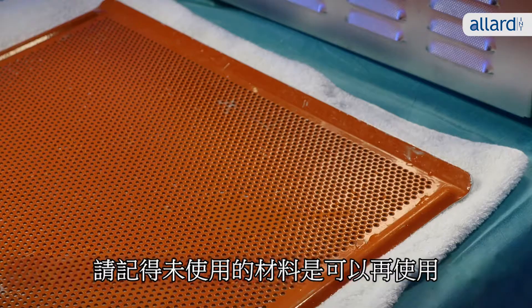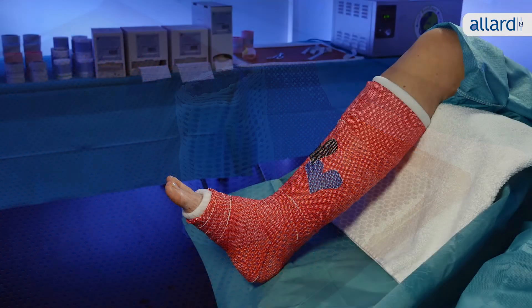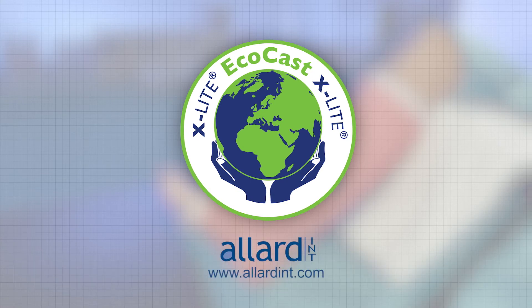Remember, you can reuse material not used. EcoCast — environmentally friendly and easy to use. For more information, please visit allardint.com.